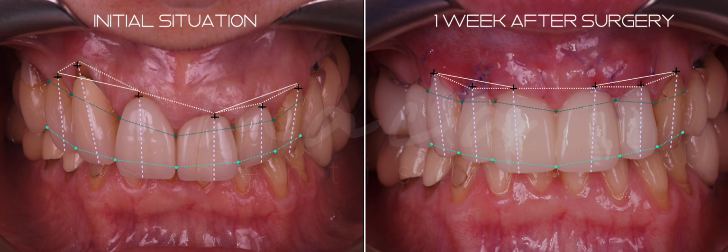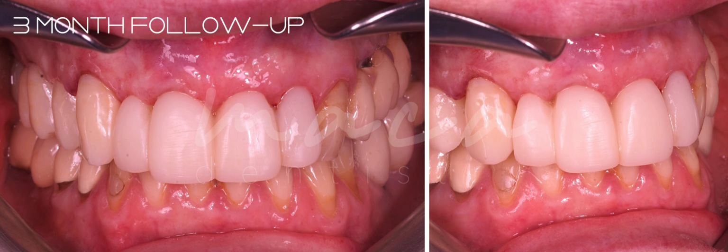And here, a comparison between the initial situation and 1 week after the surgery. We can already note big improvements. Not only does she now have the right lateral incisor that was missing, but also better tooth proportions, and the deep bite has also improved. Also, we can observe that the gingival margins are much more harmonious now. This is a 3-month follow-up.